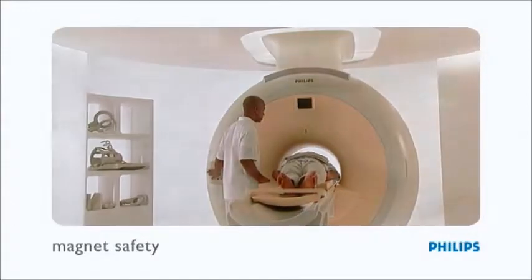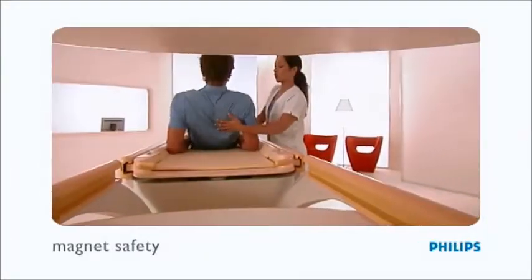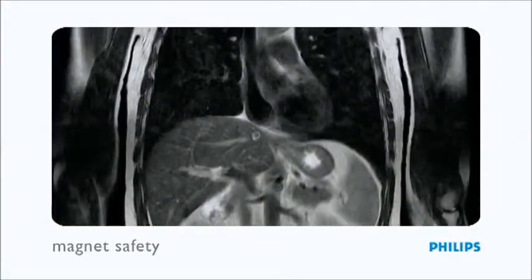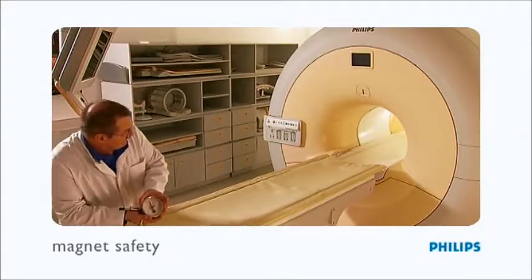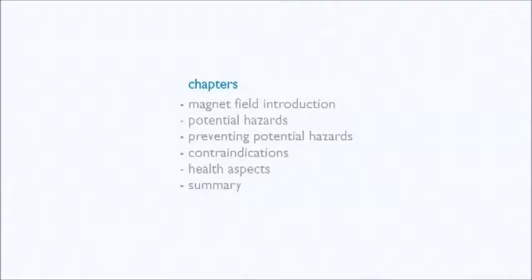The information in this presentation applies to all MR systems, regardless of magnet field strength. MR uses a powerful magnet to create images of the interior of the body. Because the magnet is so powerful, certain precautions are needed. This video starts with a brief introduction to the magnetic field of MR systems.